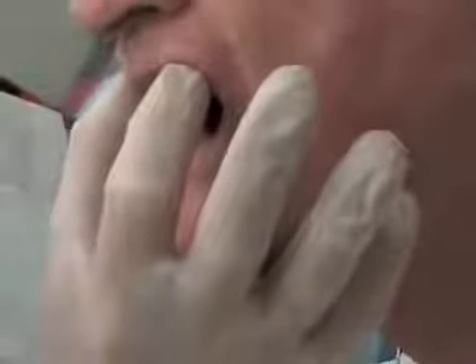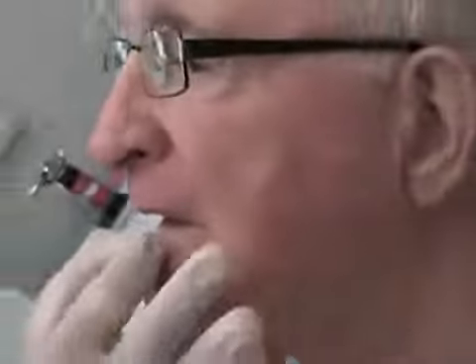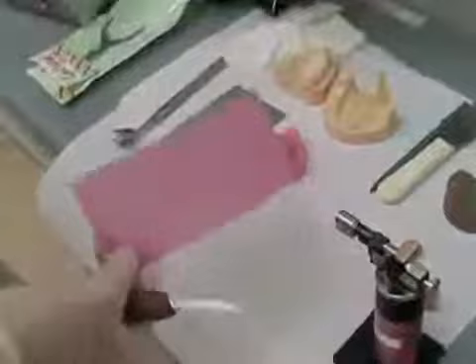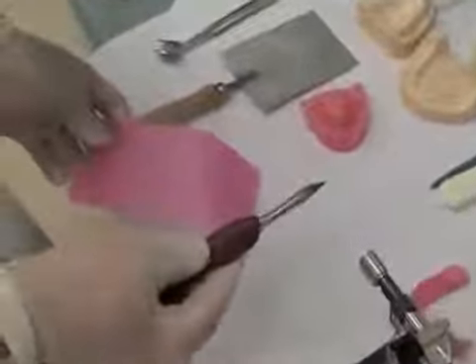This rim is a little bit too short and doesn't provide sufficient lip support. Therefore, we'll probably add some wax to both the facial and the occlusal surface. Use a Bunsen burner or a butane torch to soften the base plate wax you're going to add. It should be soft enough that it's drooping on its own weight. Heat your knife if you need to cut strips of it to add onto the surface.